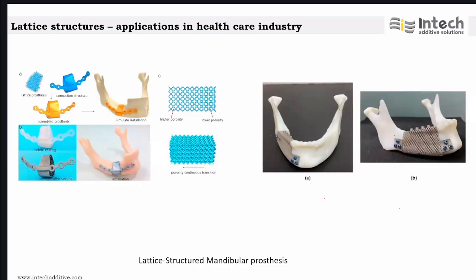Now you see the next combination, 0 and 1. You can see that it is latticing that has been done. So basically what we got is 3D printed titanium mandibular reconstruction plates with integrated lattice windows, which has been mounted on jaw models with screws.